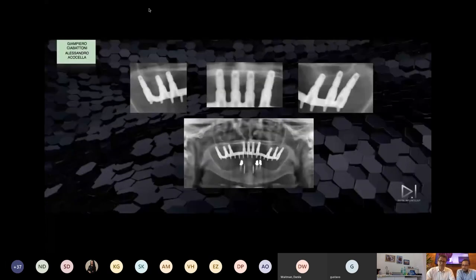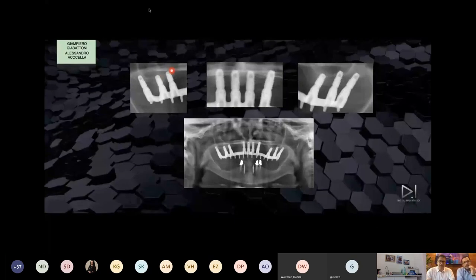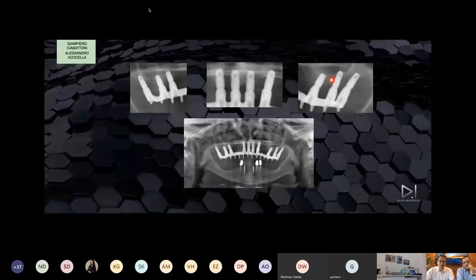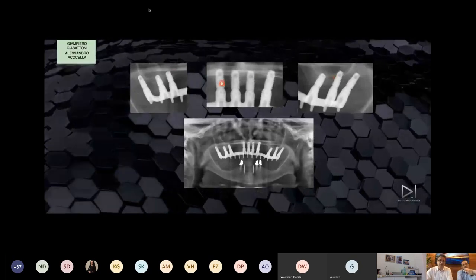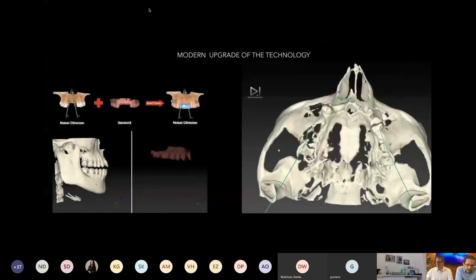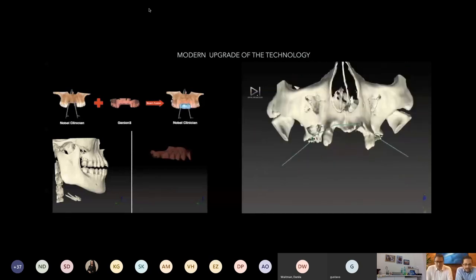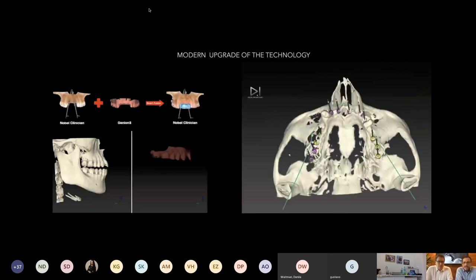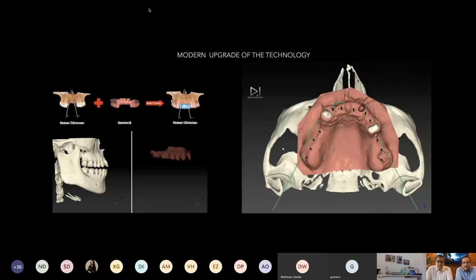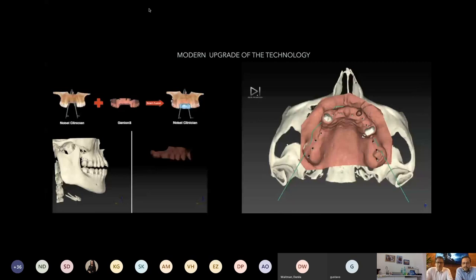This is the fitting of the bar. Immediately, you can see here elevation, and we try to have also here in part elevation. Here we expand the bone. So you see the treatment of the gold standard of full arch hard cases, but this is for full edentulous protocols. That doesn't mean that we manage the patient using the double scanning technique. We use a denture with gutta-percha markers inside. We use some silicone index and radiological index to manage the patient.